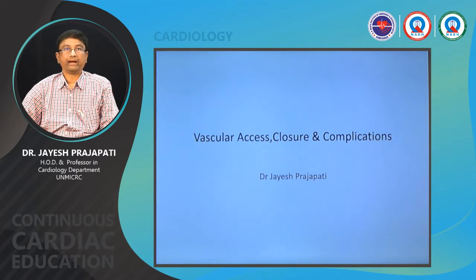So, dear friends, today I am going to discuss vascular access closure and its complications. We know that vascular access is one of the important things in interventional cardiology, and we need access for almost all procedures, like common procedures such as coronary angiography, angioplasty, and peripheral interventions. Nowadays interventional cardiology has expanded to TAVI and TEVAR, and we are taking access from 4 French to larger sizes, up to 20 French or more.